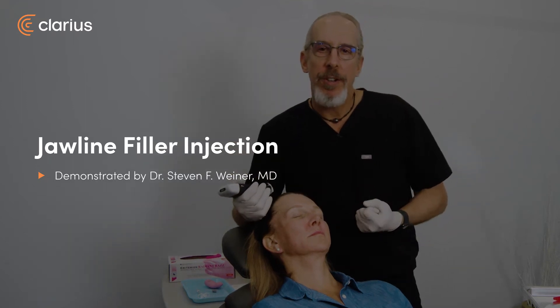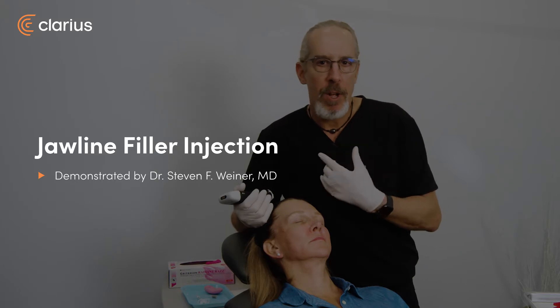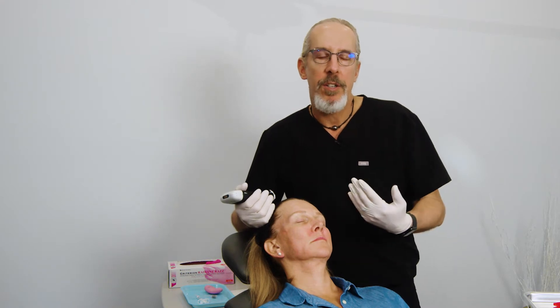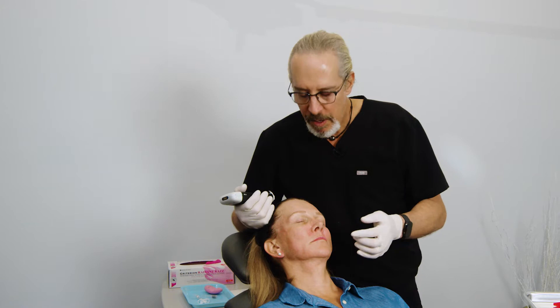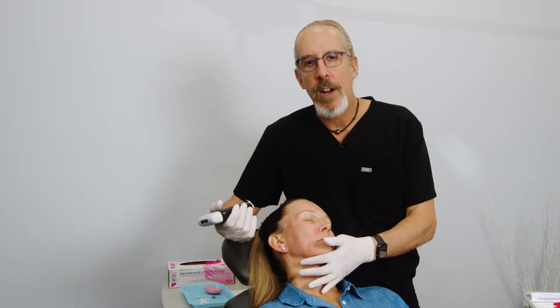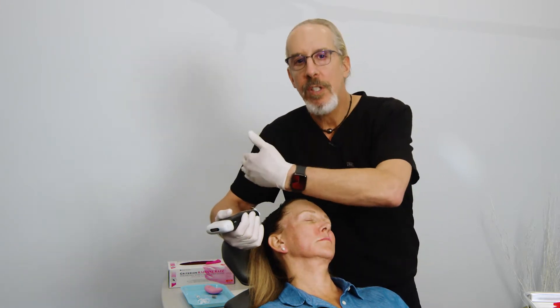At this point we are going to be injecting the jawline. We're going to do two boluses along the periosteum near the gonial angle. Really the only vasculature that is important in this area is the facial artery. The facial comes up through the antagonial notch right here. So I'm going to identify where the facial artery is and then make sure that our injections are posterior to that.